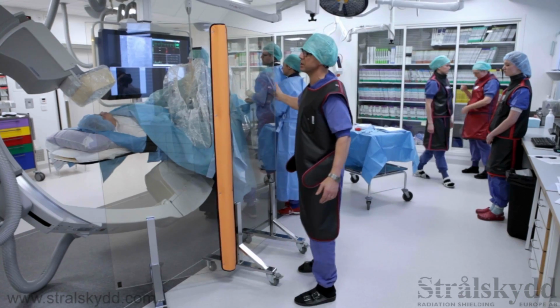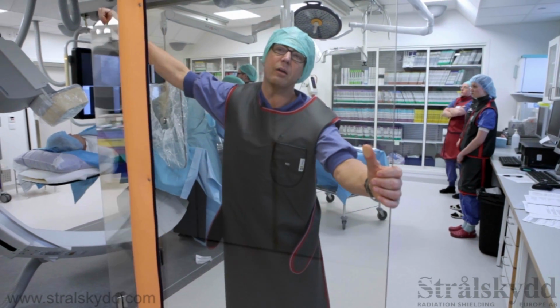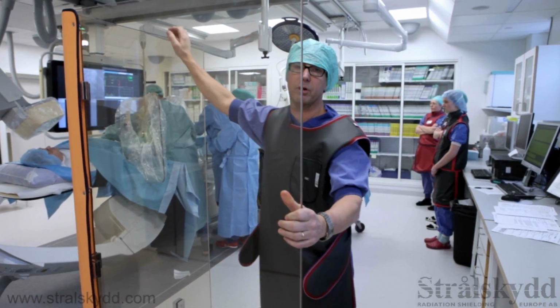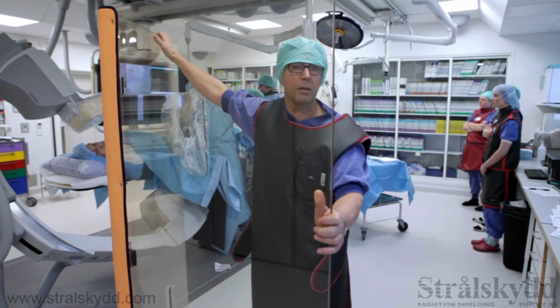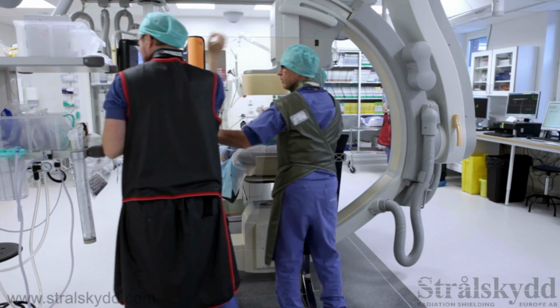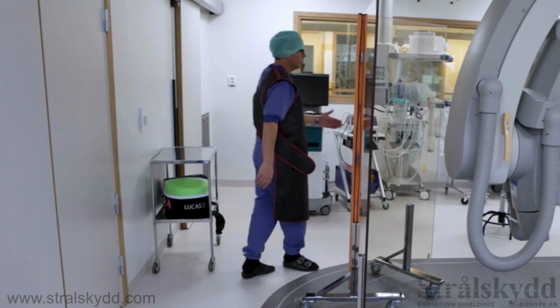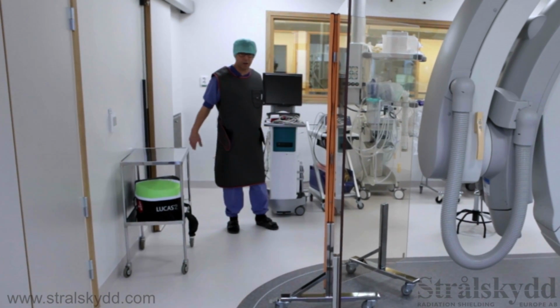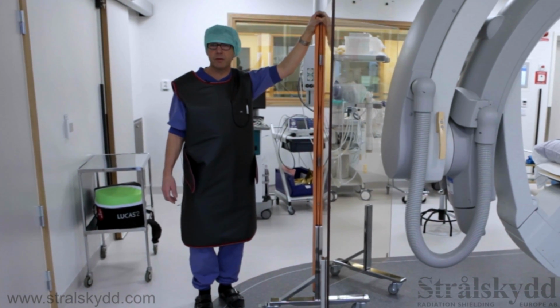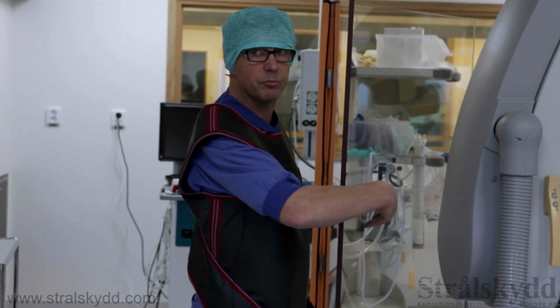And I'm just going to show that if I would have an emergency situation, I will swing the X-ray tube, position this part at the patient's head end, and the other part will be sort of angled in the appropriate way. This would be the position in an emergency situation, where I would have the side protecting all the way over here and the other part protecting something like this, which means that in this scenario approximately 1/3 of the room is completely protected. Also, it's very easy to just put my hand around and ventilate the patient.